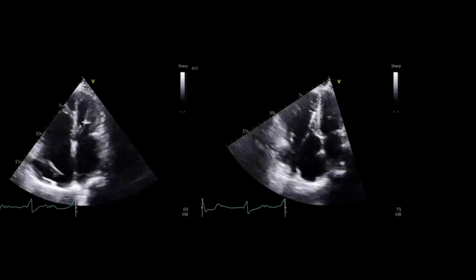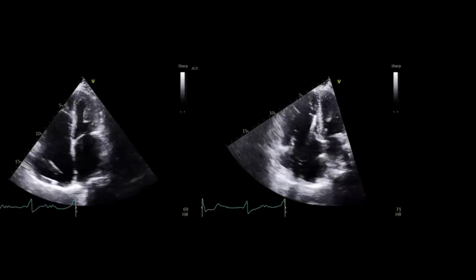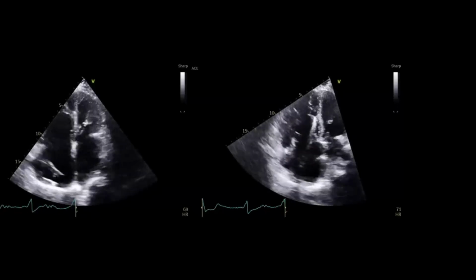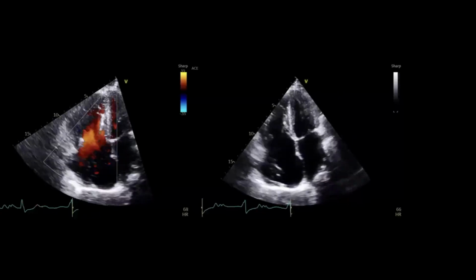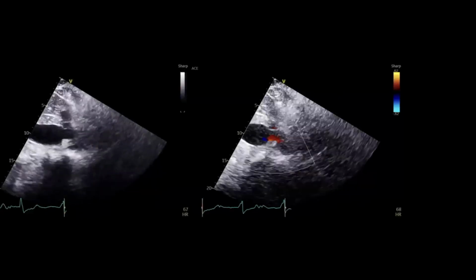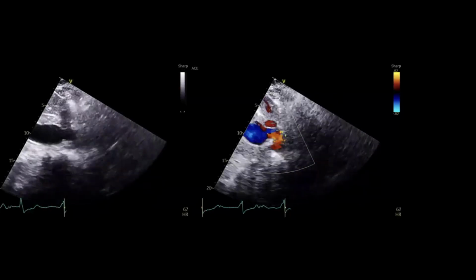I'm sure you can go to four chambers. We see this like twice a week here. Except the leaflet. So it's basically complete laminar flow, but an open tricuspid valve orifice. This is one of the situations where color flow mapping by Doppler may not work for tricuspid regurgitation. Exactly. So much of it.